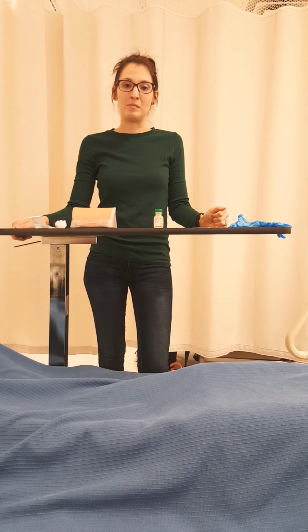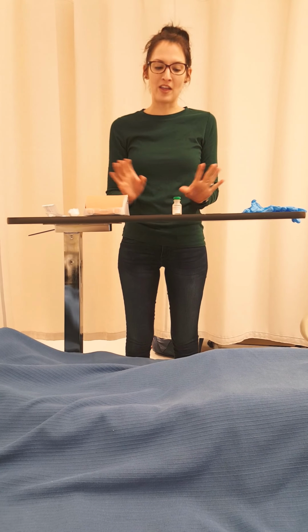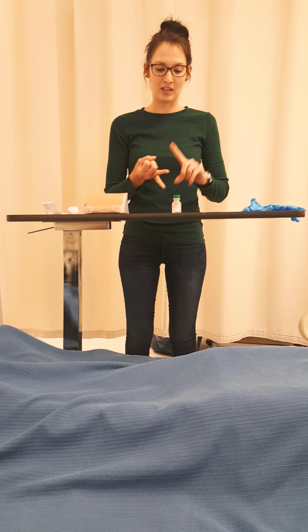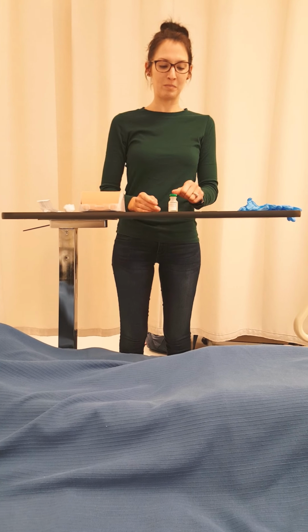Today we're going to give an IM injection. We received an order for 0.4 mils of sterile water. So first thing we're going to do is verify these orders. We're going to make sure that it's for the right patient, right medication, right dose, going to the right route, the right time. We're going to provide right documentation.